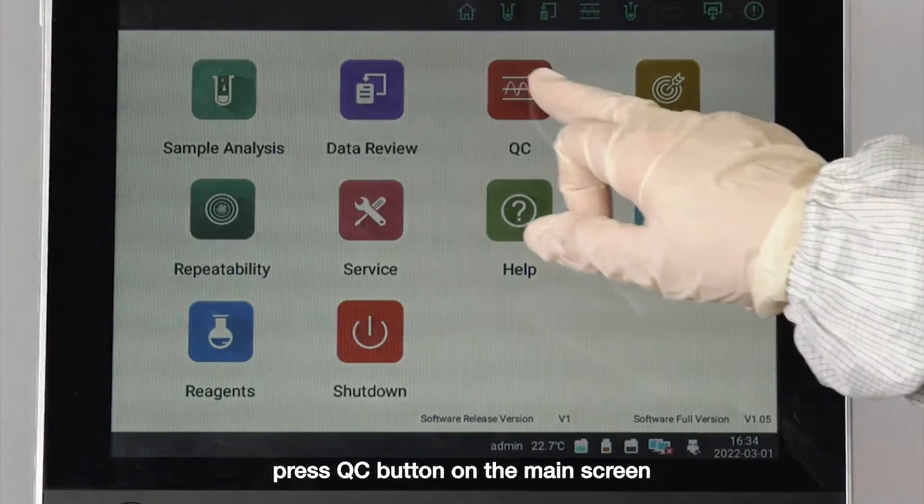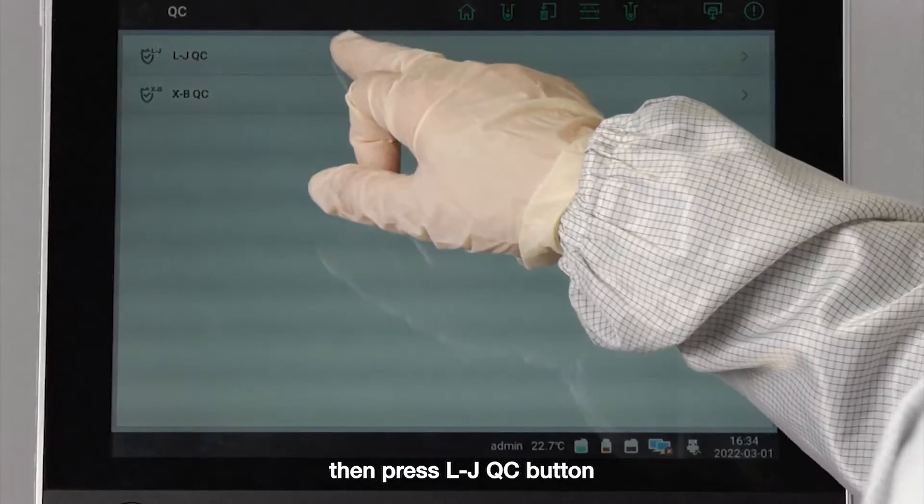Press quality control button on the main screen, then press LJ quality control button.